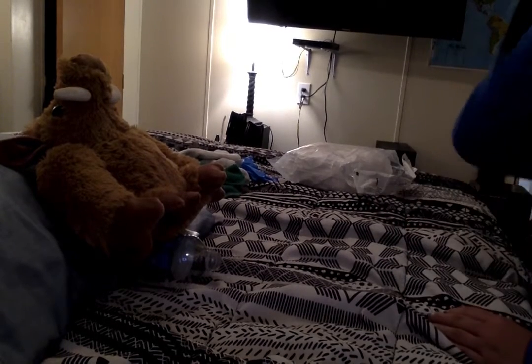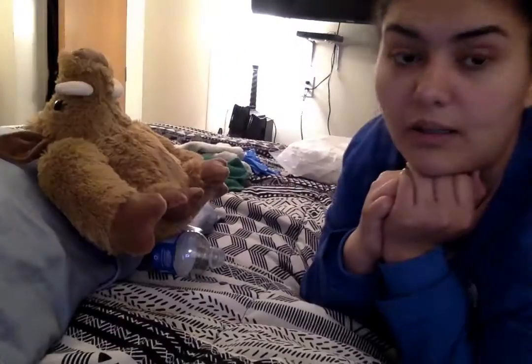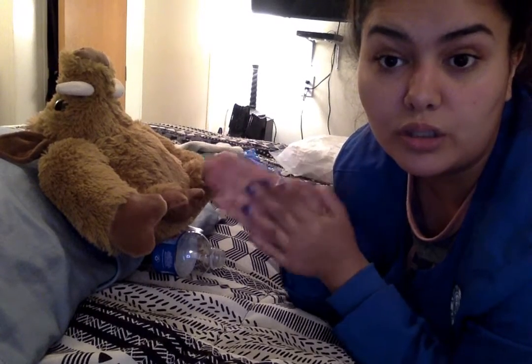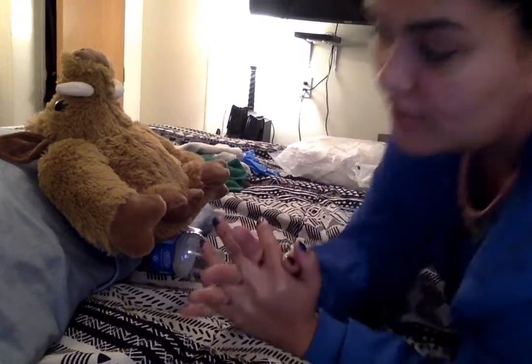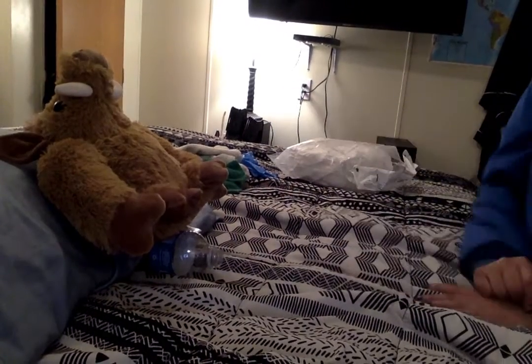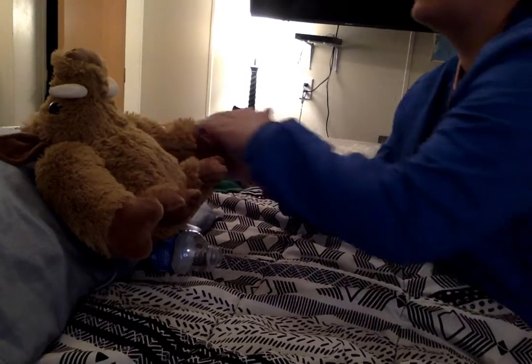I'm going to provide for the patient's privacy. So if there were any people visiting her, I would ask them at this time if they could please step out, and I would also close the curtain around the patient's bed to ensure that nobody accidentally walks in on us doing this Foley catheter insertion.